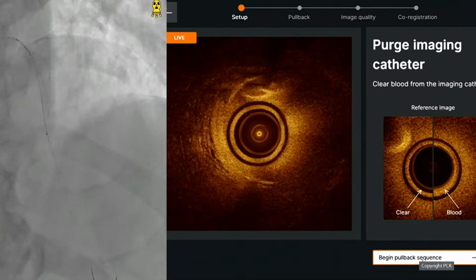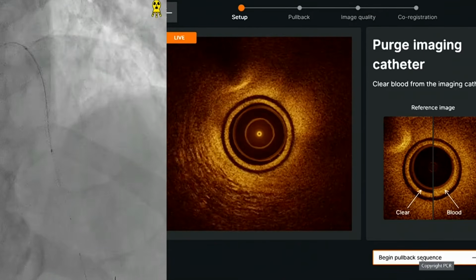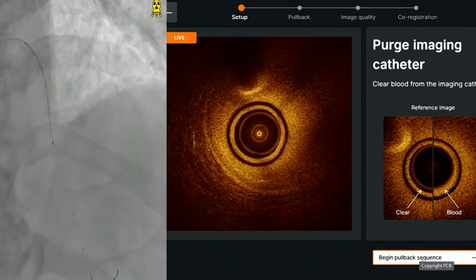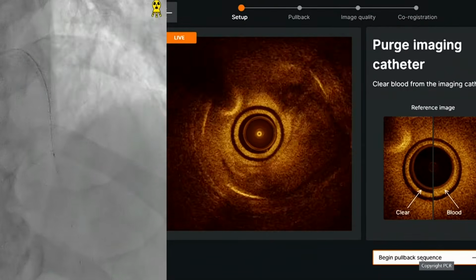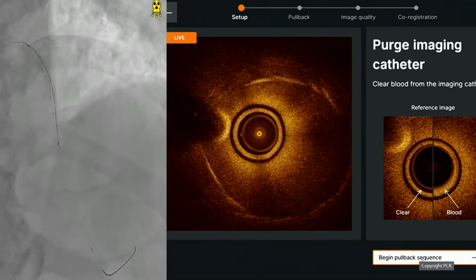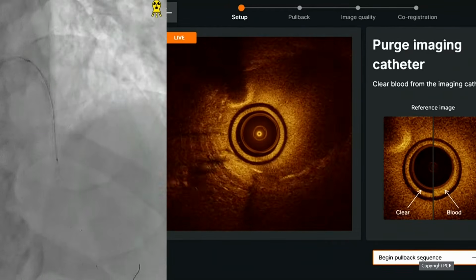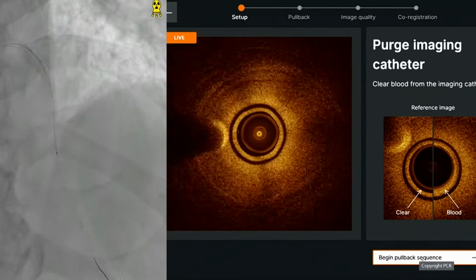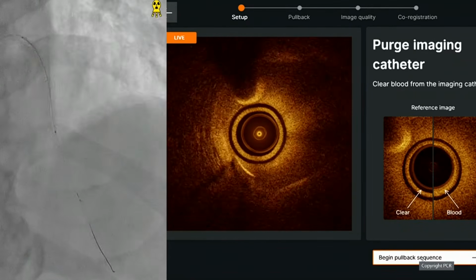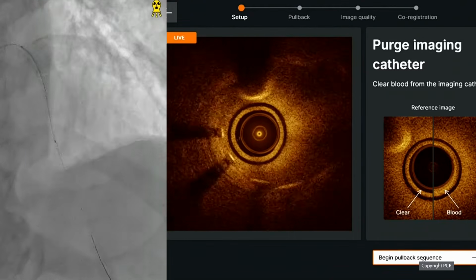Here you can see that you are still inside the stent. Now you are outside the stent. So you needed to advance a couple of millimeters more to be sure that there is no dissection. Here you are at the border, depending upon the flow. So you needed to advance 1 or 2 millimeters. Not quite. This is the maximum we can go because of the distal lesion.